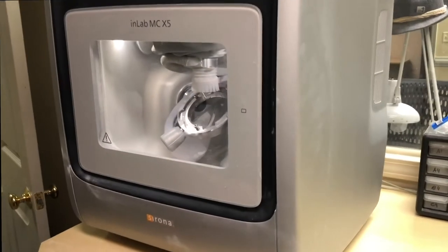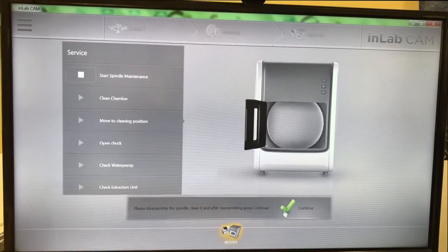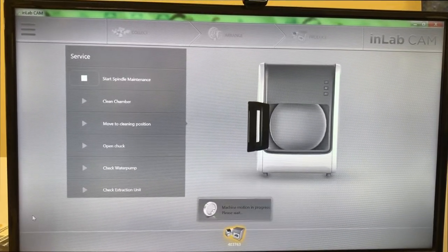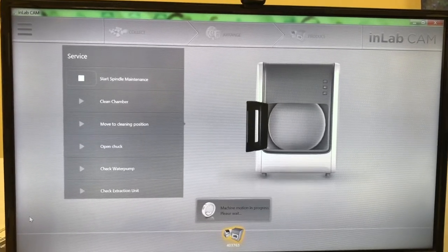We'll go back to our computer. Now that we're back on our computer, all you have to do is press Continue, and when it finishes, exit your CAM software. You're ready to go, and that is your Tech Tip 2.